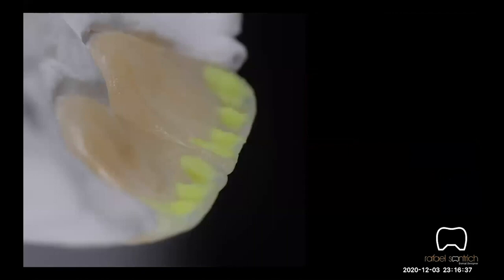For example, if you put in the concavity, blue in the distal and mesial, a little bit of chroma in the mamelons in the middle of the tooth. The idea is to try to follow the same color with the ceramic. So if I put blue stain in distal and mesial, I need to put a blue enamel in distal and mesial. If I put a little bit of cream in the mamelon area, I need to put a little bit of mamelon light.